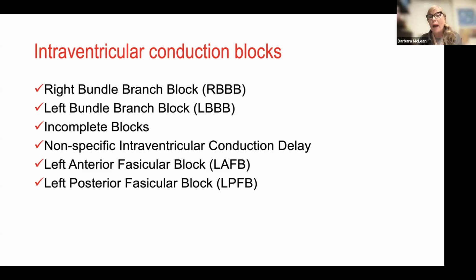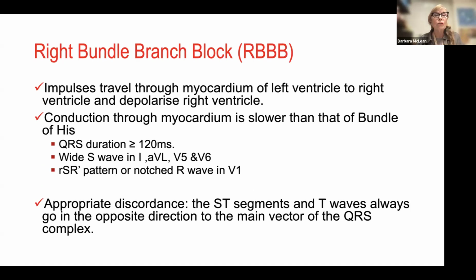And if you don't really have great skills, and it takes a long time to acquire it, and we practice, and always have to be sure that we're going to be wrong about 50% of the time, no matter how great we are. Even the greatest cardiologists should admit to you they're going to be wrong sometimes about how they evaluate the EKG. So the idea here is practice, and practice. You see something interesting, you look at it, you send the image to me, you tell me what you think it is, and I'll tell you if I agree. Doesn't mean I'm right, doesn't mean you're right, just means that we either agree or we disagree. But you've got to practice, and you know what? You have to do it every single day.